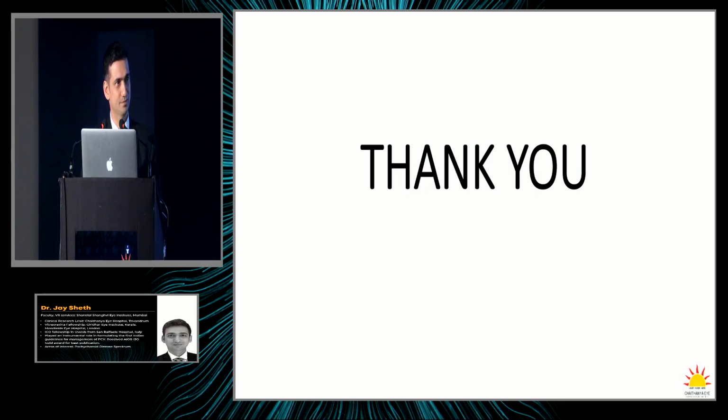Do you have a comment? No, I just think about the positioning of the OCTA machine. A lot of times you have the AC vent which comes right into the patient's eye, and they need to keep their eye open and tend to blink. So that's one thing you need to pay attention to. It's very common because the person who keeps the machine doesn't know that it has to be done a certain way. Ergonomics of the machine have to be considered.